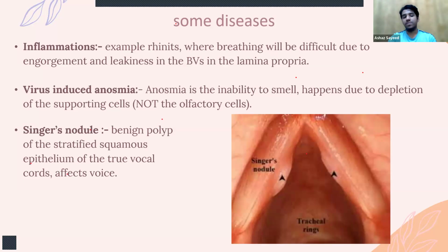Now you have Singer's nodule. Look at the image. It's just a benign polyp of stratified squamous epithelium of the true vocal cord. It affects your voice. It's just that. Just know about Singer's nodule.